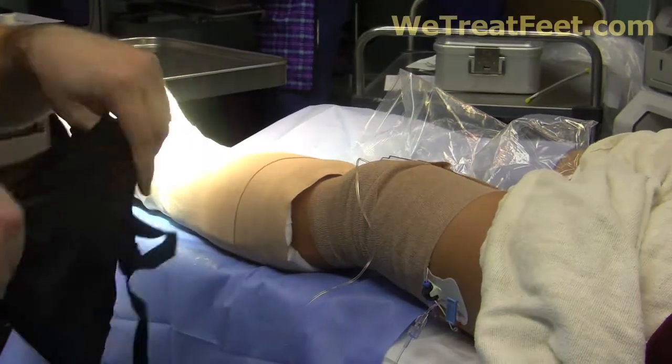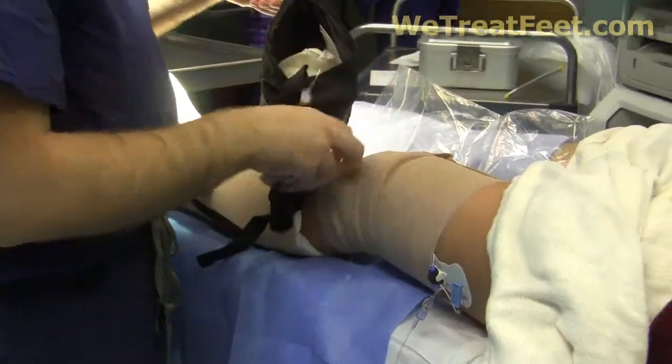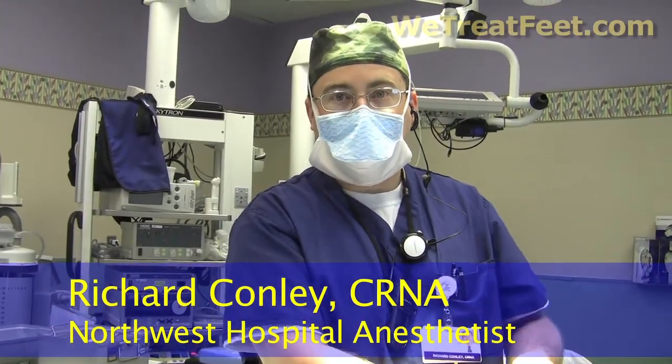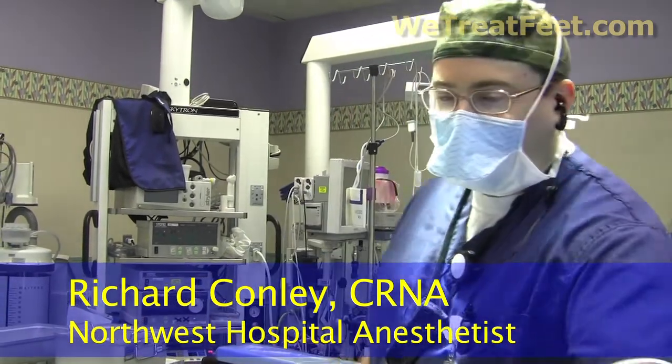The pump conveniently fits into this little bag where there are instructions. The sensation is gone, but the motor function will remain, so even if they can't feel it, they could still move their foot if they needed to. But the majority of the time, they just have it in a cast or a splint, so they just keep the foot still and it's numb for about 3 to 5 days, depending on the size pump that we put on.